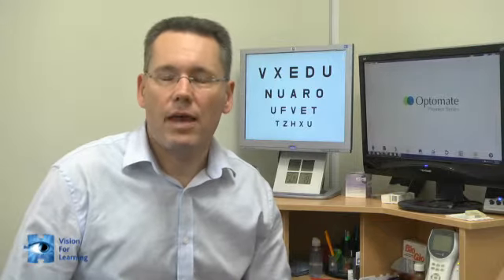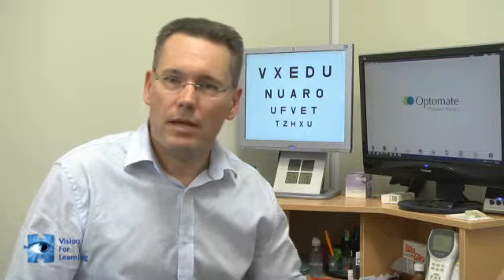One advantage of doing the test at school is that the teacher can run a brief reading test with the lenses in front and get some idea as to whether the student is able to read more fluently, accurately, and so on. If the teacher feels that this makes a difference, then this information can be passed across to the optometrist at the time of the referral.